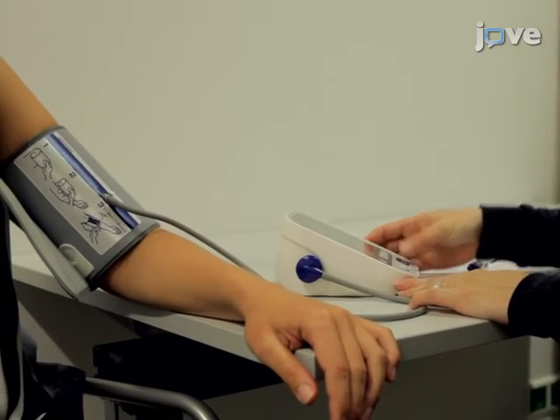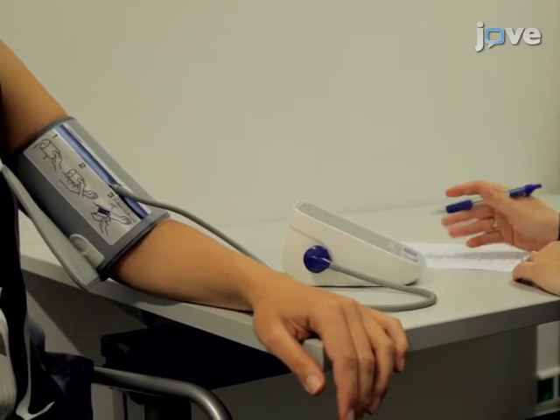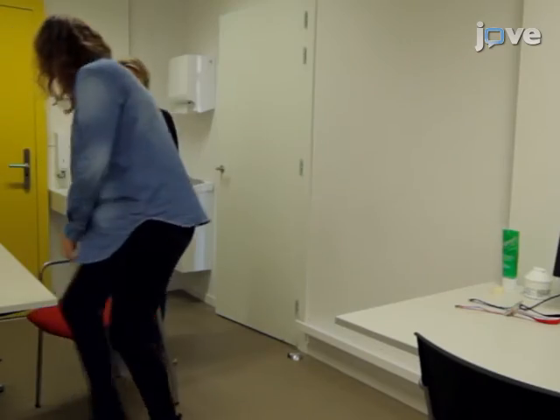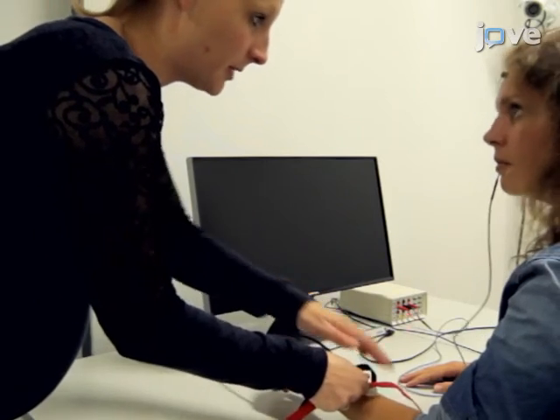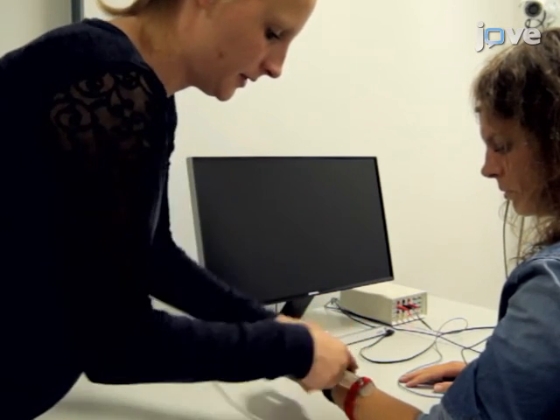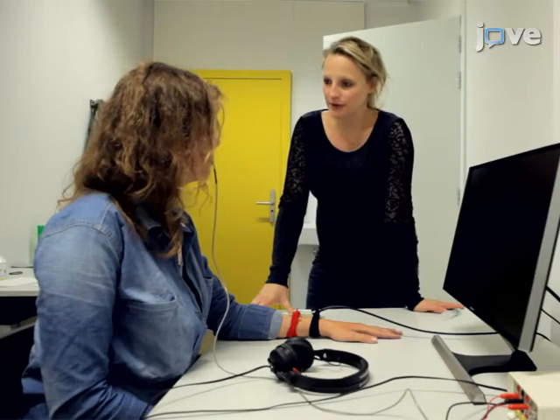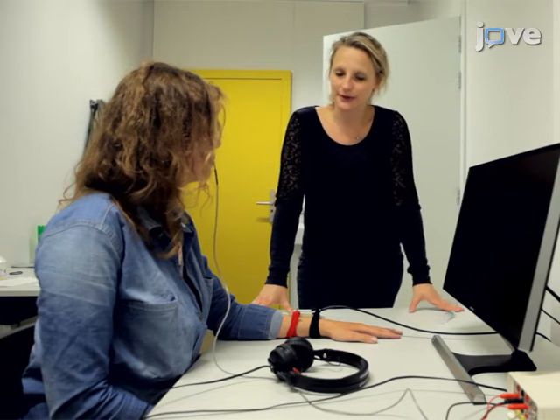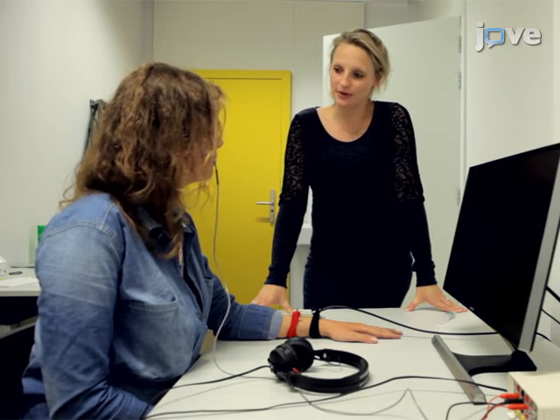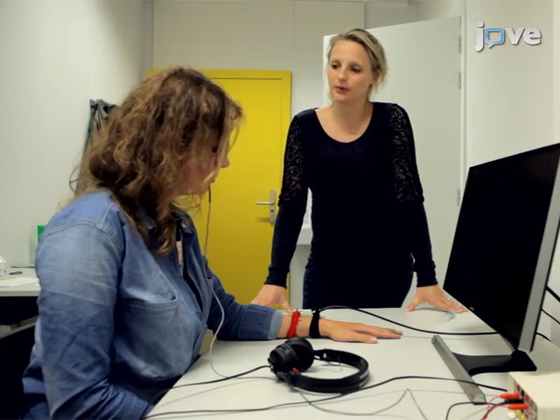Again, obtain blood pressure and heart rate measurements as well as salivary samples after 90 minutes. After collecting blood pressure and heart rate measurements, position the participant in front of the computer screen and attach the EMG and shock electrodes. Inform the participant that the intensity of shock will remain the same. Instruct the participants that the same two pictures will be presented on the computer screen, and again instruct them to report the expectancy of an electric shock during the presentation of all pictures.